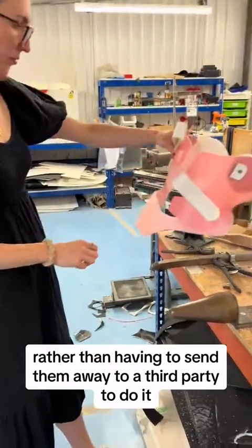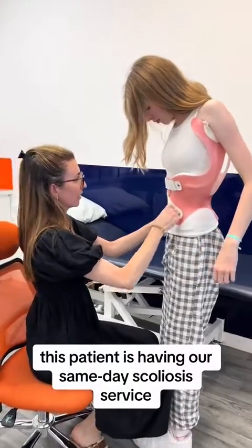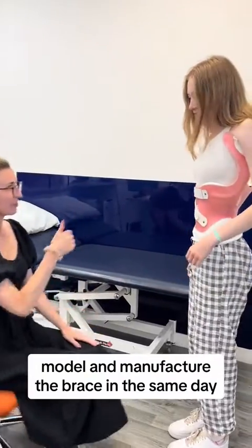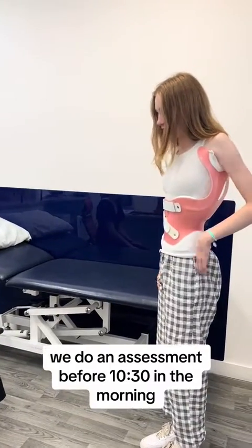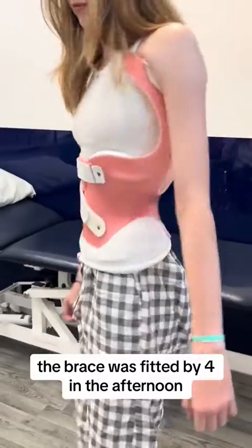Rather than having to send them away to a third party, this patient is having our same-day scoliosis service, where we assess, model, and manufacture the brace in the same day. We do an assessment at 10:30 in the morning, and in this case the brace was fitted by four in the afternoon.